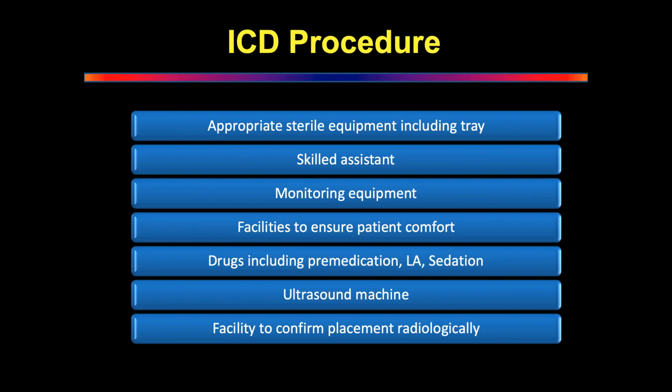If you've got a small pneumothorax, what are you going to do? We can start with 22. 8 to 14 French, a smaller size, with Seldinger technique, a fine bore pigtail. What else will you do for a large pneumothorax? I thought for the small we would go for 22. 22, 24. I would only be guessing.